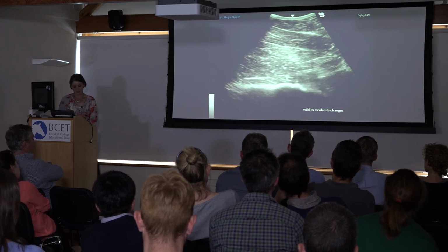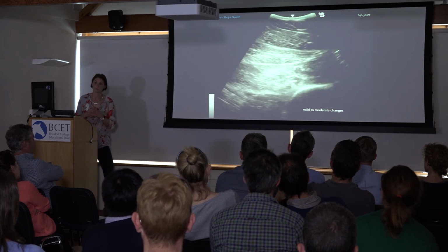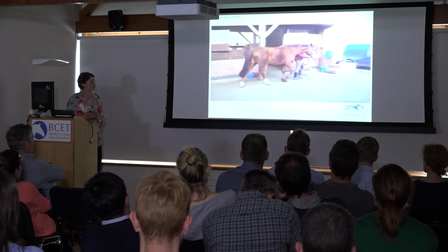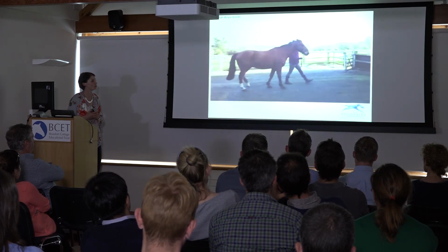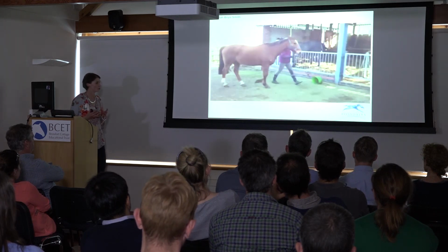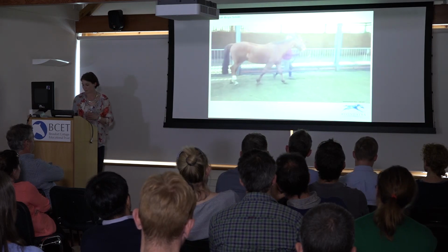You know, in big horses, the hip joint is difficult to visualize. So in your big warmbloods, etc., it's very hard to get good diagnostic images of the pelvis, particularly the hip area. In thoroughbreds, etc., it is obviously a lot easier, but I do appreciate it is quite difficult in these big horses. And these horses often present with quite a marked lameness, quite a significant reduction in that cranial phase, and they don't respond well to conservative management or to rest. They tend to remain, unfortunately, very lame.